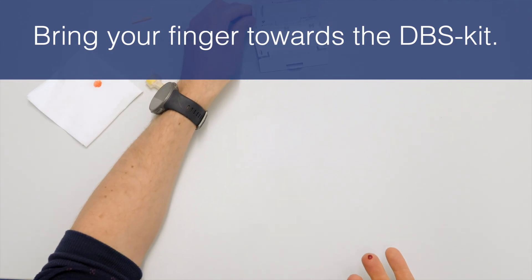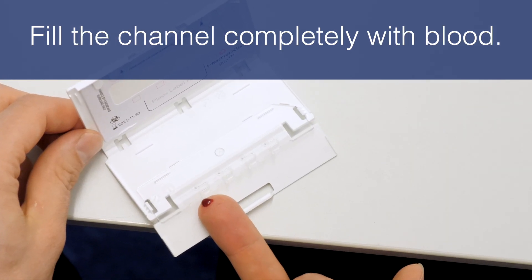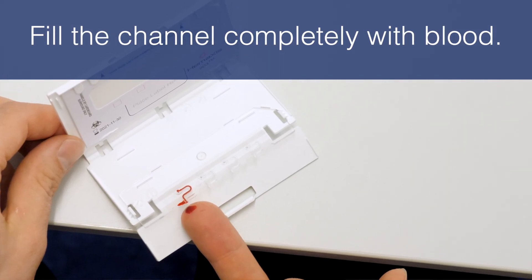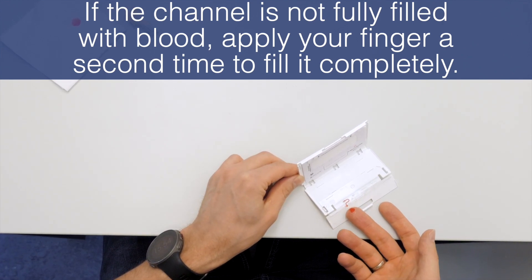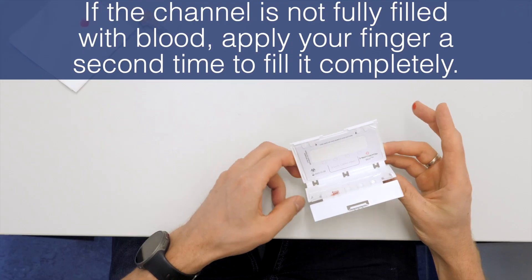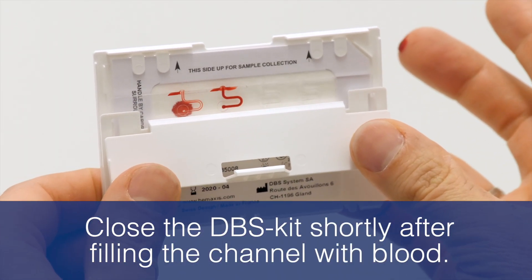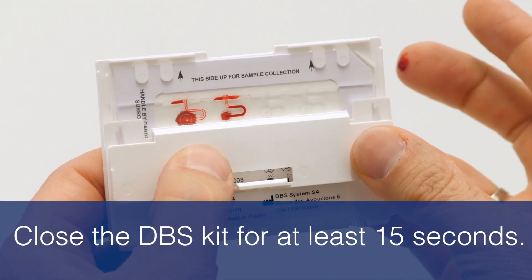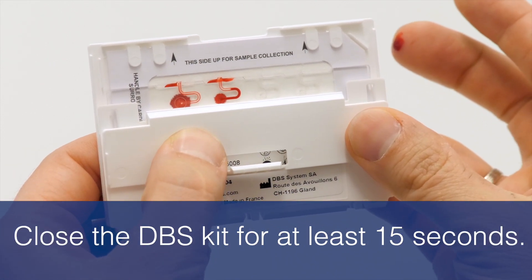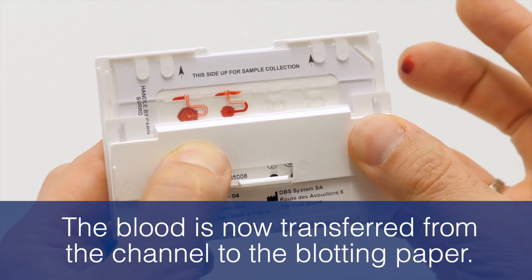Bring your finger towards the DBS kit and choose an unused blood sampling channel. Fill the channel completely with blood. If the channel is not fully filled, apply your finger a second time to fill it completely. Close the DBS kit shortly after filling the channel with blood, to prevent the blood from clotting and not forming a proper blood spot. Close the DBS kit for at least 15 seconds. Make sure the blood is completely transferred from the channel to the blotting paper.